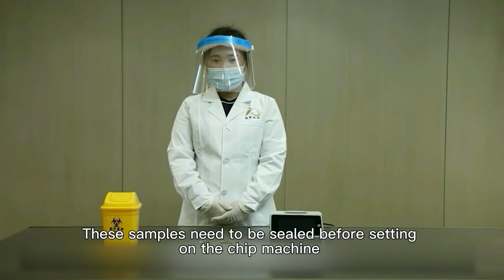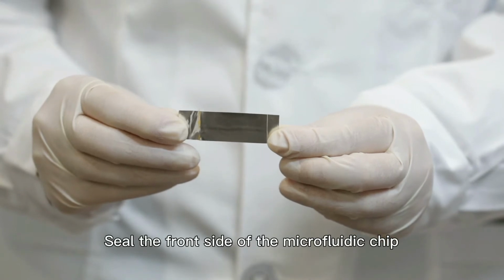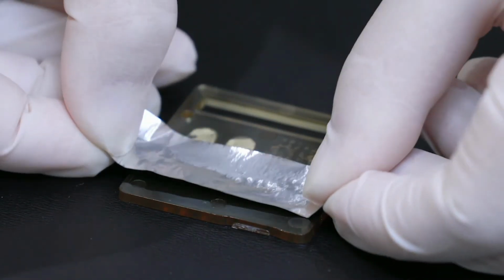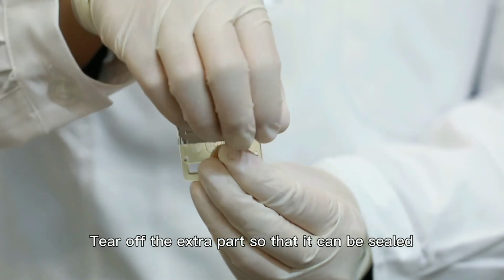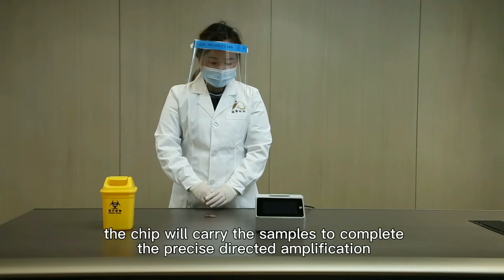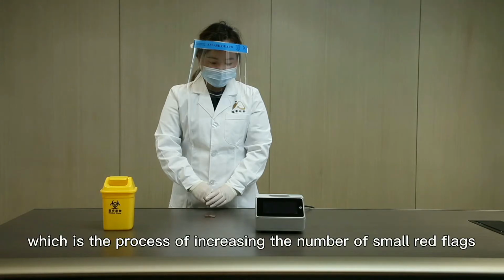These samples need to be sealed before setting on the chip machine. Seal the front side of the microfluidic chip with the tin foil prepared in the package. Tear off the extra part so that it can be sealed. Next, the chip will carry the samples to complete the precise directed amplification in the Xuanwu first generation equipment, which is the process of increasing the number of small red flags.